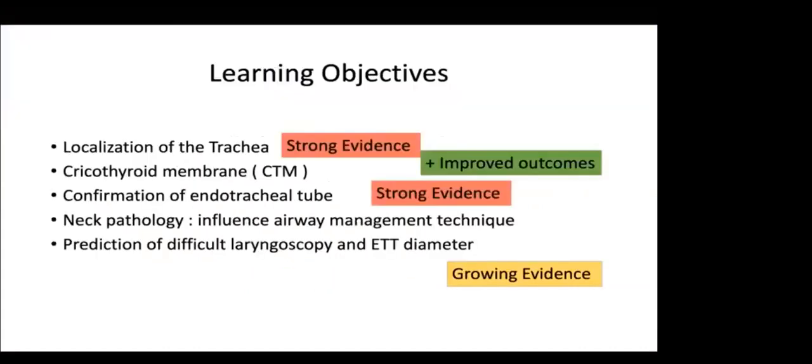There are many applications of ultrasound in upper airway management. In this brief presentation, I would give an overview of the important applications for upper airway ultrasonography and talk more in detail on the ones that are more important and backed by strong evidence. Also going to touch upon some applications such as identification of neck pathology, hematoma, and prediction of difficult laryngoscopy using ultrasonography.